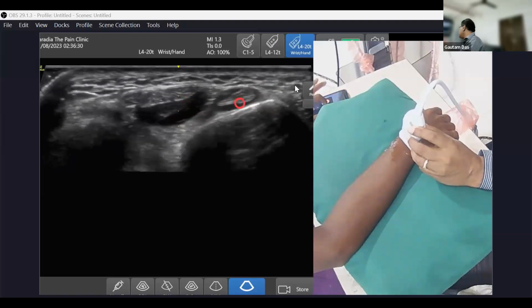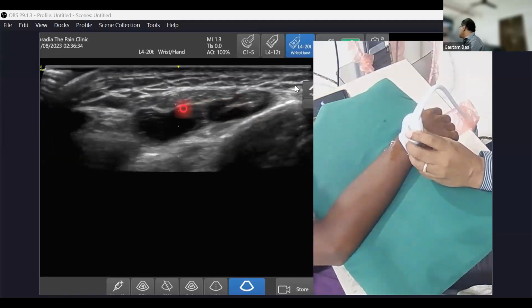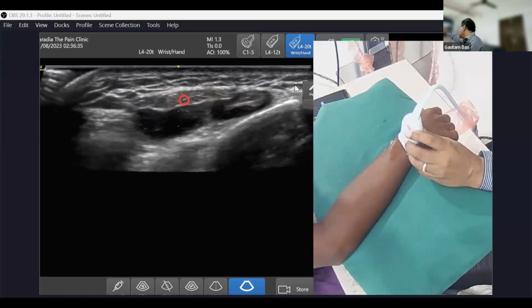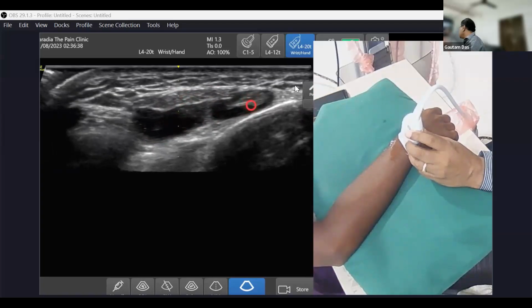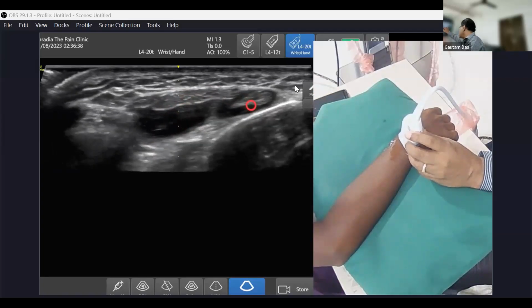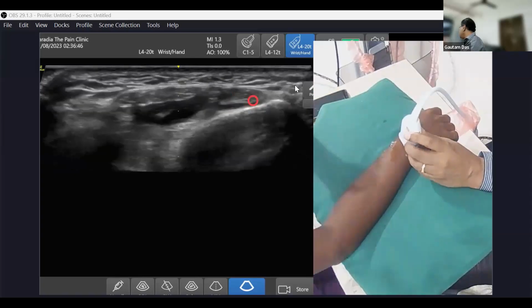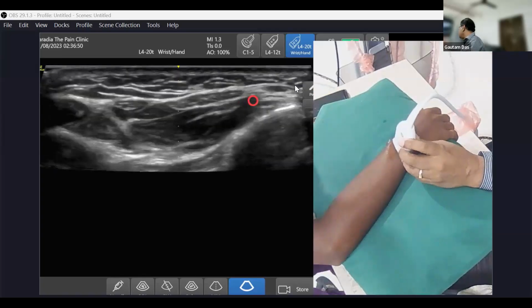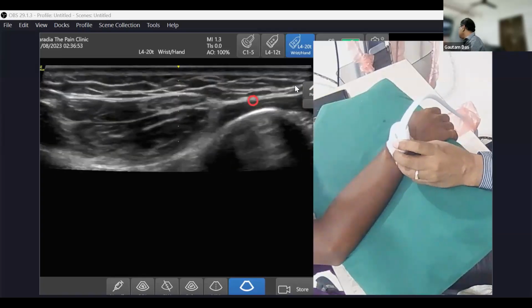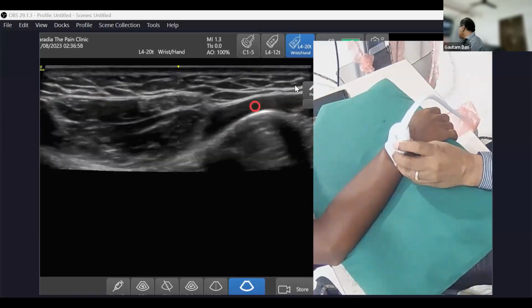They will be crossing below this, you see, this was your extensor digitorum. This was the extensor indicis, this was the extensor pollicis. If I'm tracing it more proximally, these two muscles, first one is your extensor indicis and this is the extensor pollicis. They will be going below these extensor digitorum muscles and going to the radial, sorry, ulnar side. And then the other, this was your first compartment muscle, abductor pollicis longus, extensor pollicis brevis. They also will be coming.